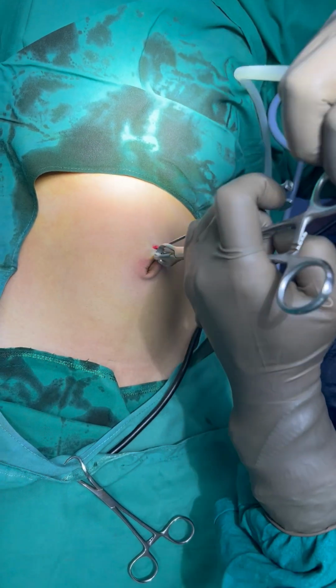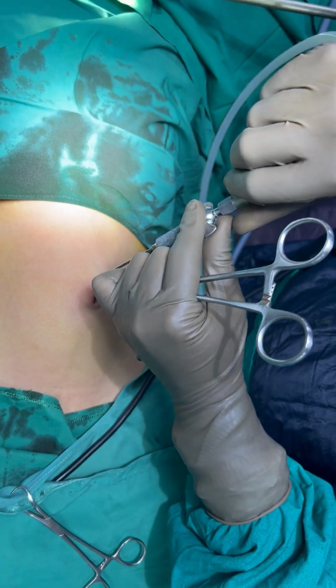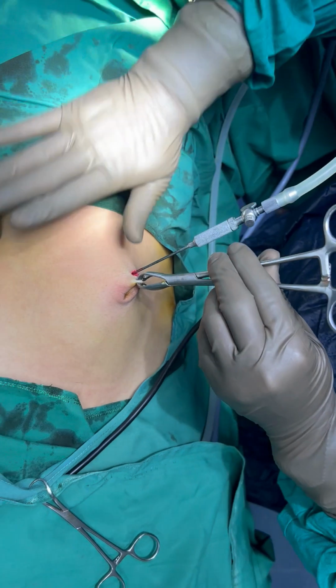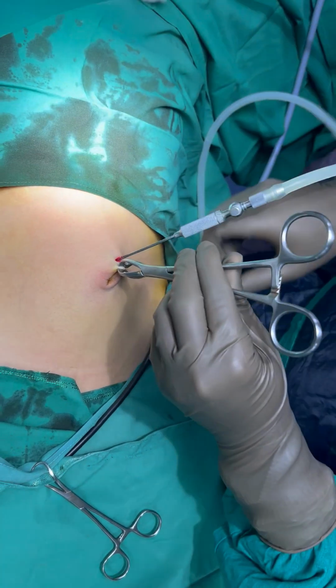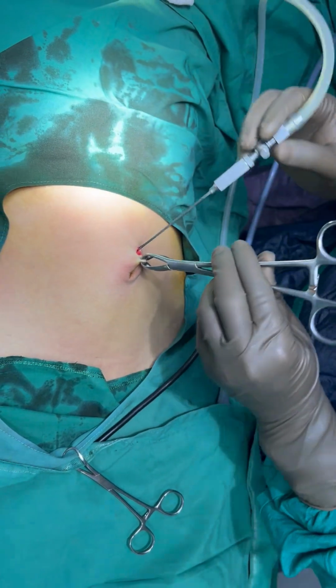There are other tests also, that is a teardrop test, aspiration and pressure test. We are not performing that. We are doing, there is a free movement into the peritoneal cavity.